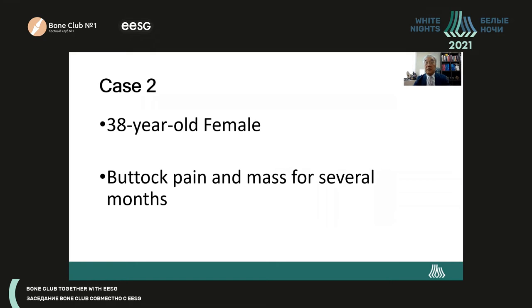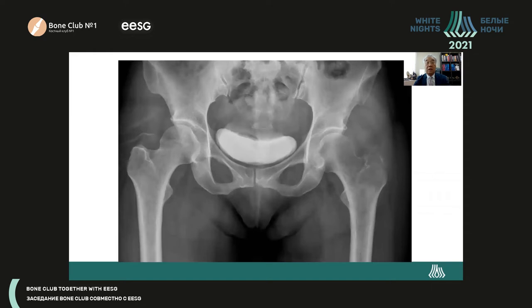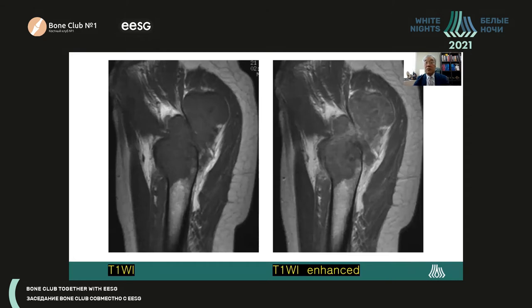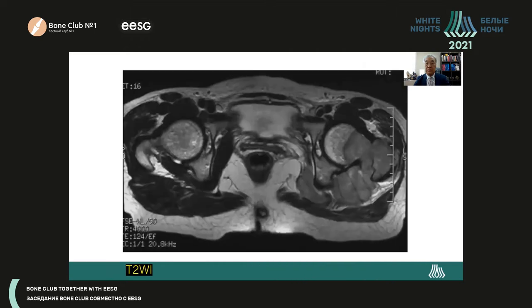Case number two is a 38-year-old female who had pain and a mass in her buttock area for several months. AP view of the hip shows bone destruction of the left femoral head, neck, and greater trochanter with an indistinct margin. T1-weighted MR image shows low signal intensity at the proximal femur with posterior-superior extension of a soft tissue mass. Enhanced MR image shows slight enhancement with focal non-enhanced areas. T2-weighted axial image shows diffuse involvement of the left femoral head, neck, and greater trochanter with low signal intensity.